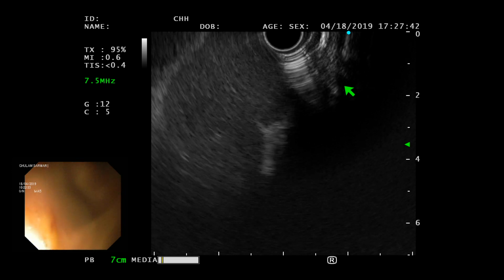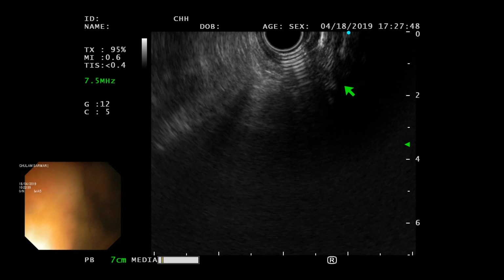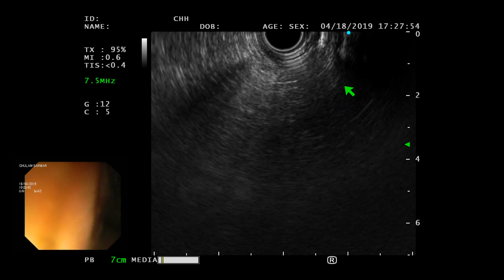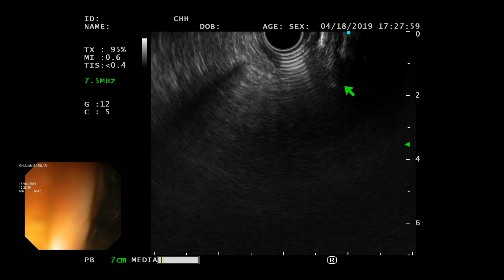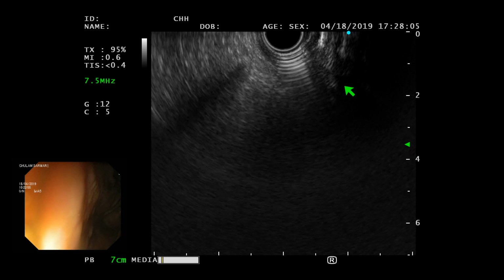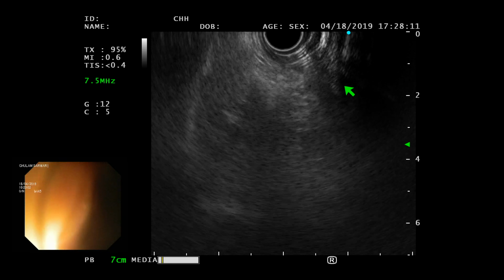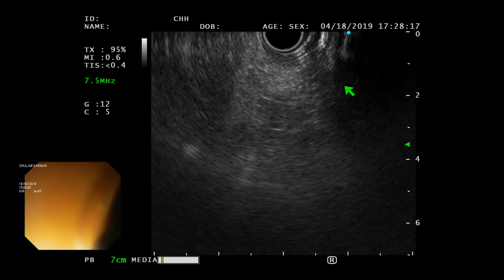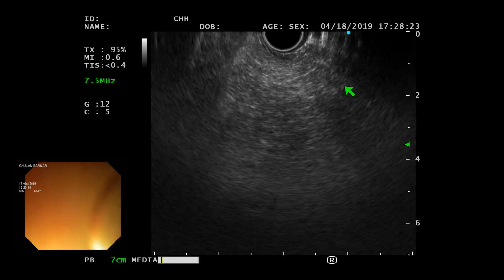I agree. I agree. Yeah, I've been thinking about that while you were not here. This is like a thickening of the whole cystic duct, thickening of the whole bile duct. So could it be some sort of cholangiopathy, autoimmune, some sort of cholangiopathy? But the only thing which bothers me is when it goes into the neck of the gallbladder, that's where the problem is. I don't see a stone there. And it looks more like a tissue to me than a sludge. But now, looking at the gallbladder, there is a huge, big stone.